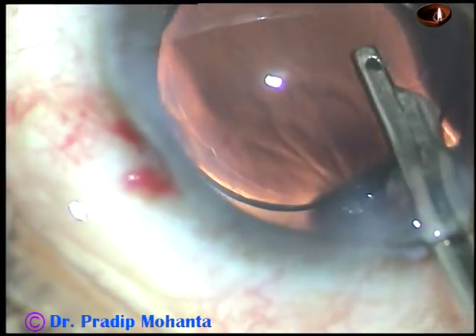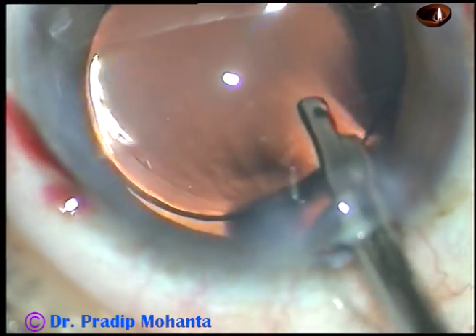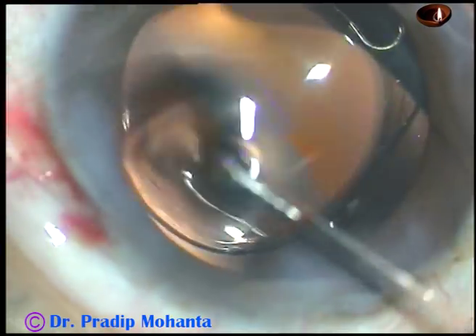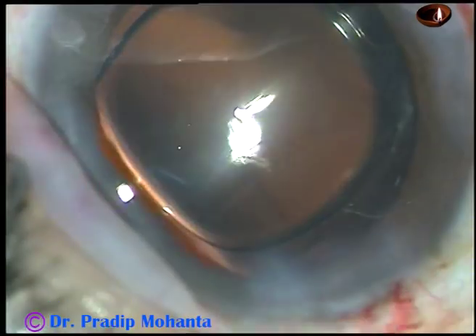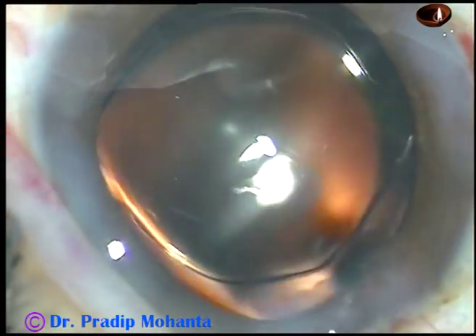Now this is how I remove the visco from the corneal endothelium. I'll show this in slow motion. Here it is. This lot of visco sticking to the corneal endothelium.